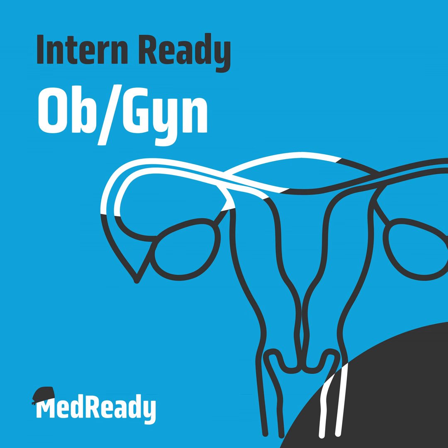The last thing I will mention is pulmonary edema, like flash pulmonary edema. We had a patient my intern year, the fluids were kind of wonky on the fluid management system. And we were like, God, there's something wrong with the machine. It's not us. And it turns out we had perfed, and the whole time it was just going into the belly, and the patient got flash pulmonary edema and she had to stay overnight. She ended up recovering just fine. But it is something to think about, being very cognizant of when the machine is wonky, don't keep going. Yeah. Maybe pause and reevaluate and make sure you haven't perforated.